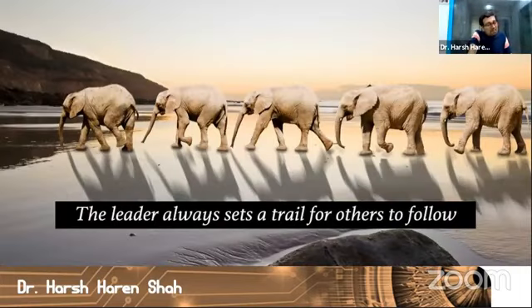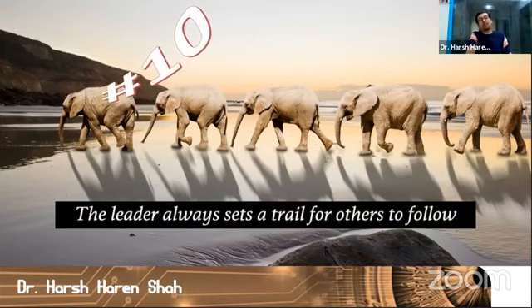So one thing that remains common irrespective of the technique you choose is that the first file to reach the apical third will always be a number 10 file, or in rare cases a file which is smaller than this, like a number 8.